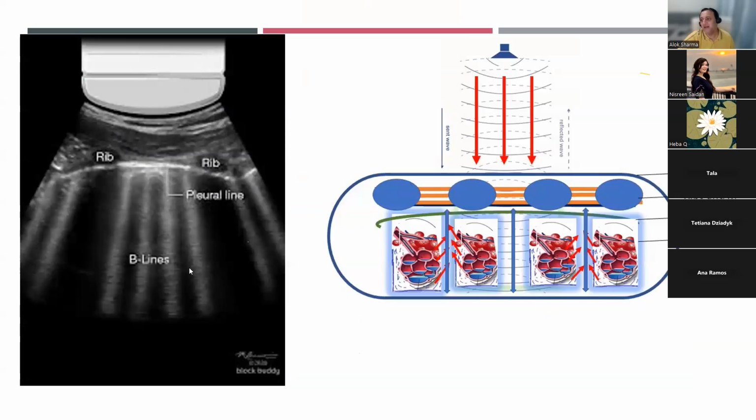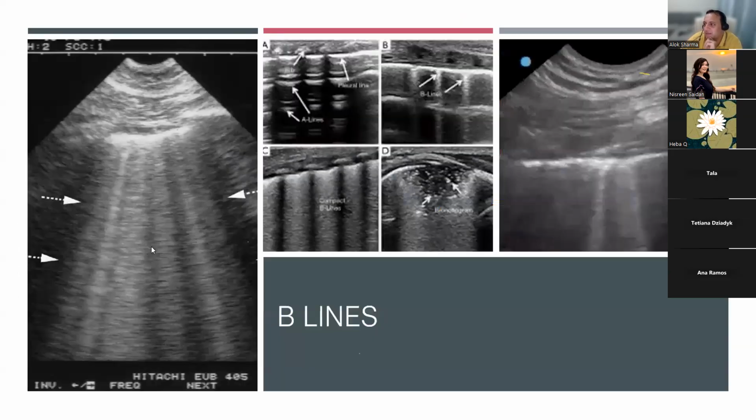These are thin, uniform B lines. So there's not a lot of fluid in this lung. There is fluid, and it's abnormal because you have more than 3 B lines. So there is interstitial edema here. And a classical example that I'll give you is transient tachypnea, a smooth pleural line with interstitial fluid that's gradually getting better. Gradually what will happen is this fluid will get resorbed and these B lines will get converted into aerated lung, which typically means that the alveolar interstitial fluid has resorbed.